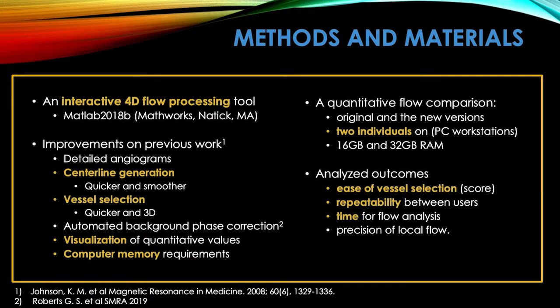And so what we did is we created an interactive 4D flow processing tool in MATLAB. Some of the improvements from the previous work are switching the angiogram generation. Before it was Gaussian-based, and now we have an iterative-based method. The centerline generation is much faster and a lot smoother. Vessel selection is switched from a 2D to a 3D system.